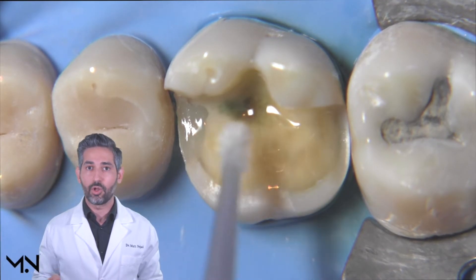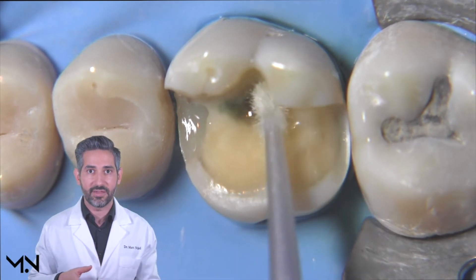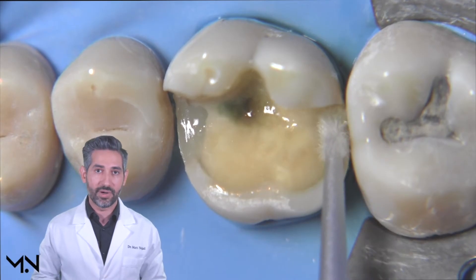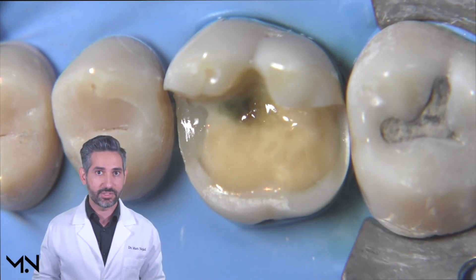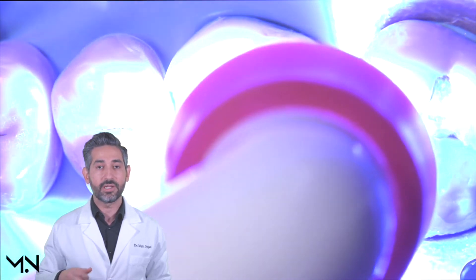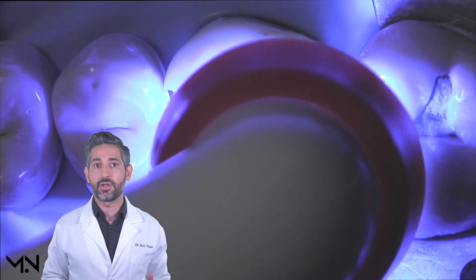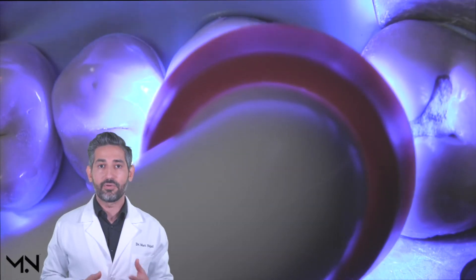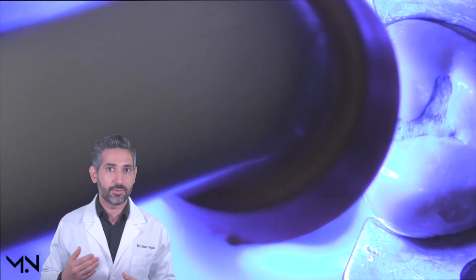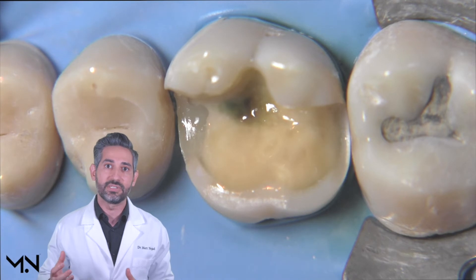When I apply the adhesive, I like to follow up with a clean dry micro brush to wick up the excess adhesive that puddles in the most concave areas. The goal is to have a nice thin layer of adhesive because I follow with flowable resin in a step called resin coating. Once you're ready, cure for 20 seconds. Remember that this bond does not develop instantly — bond formation is polymerization and it takes time, so the steps after this are designed to minimize additional stress so that the bond to dentin can form without anything opposing its full potential.